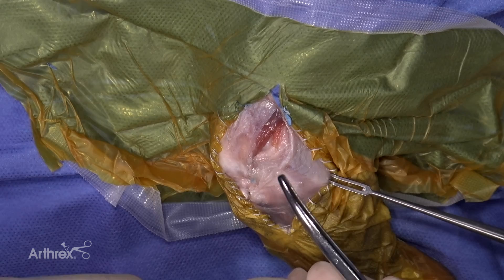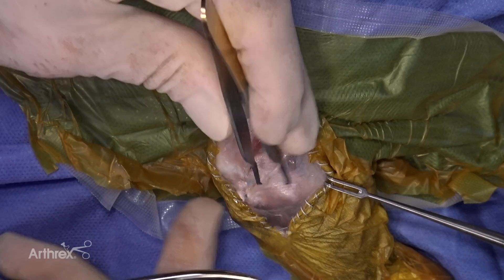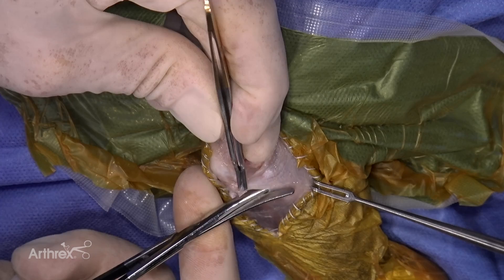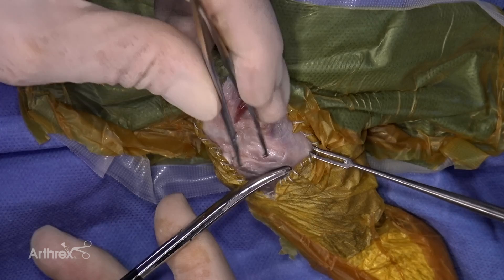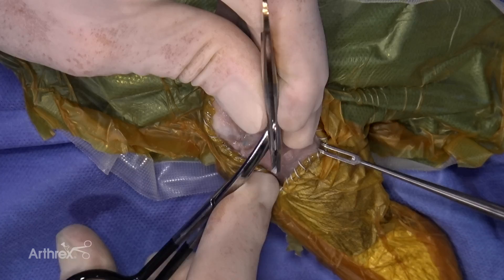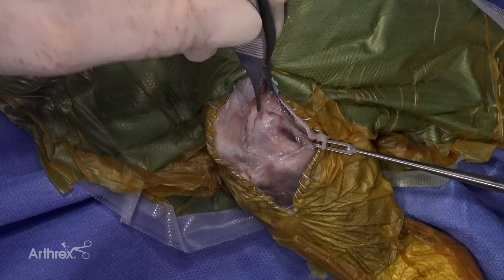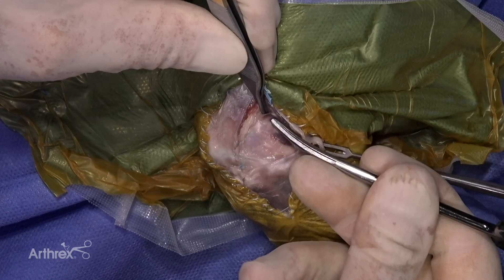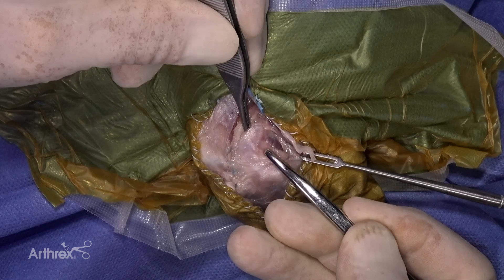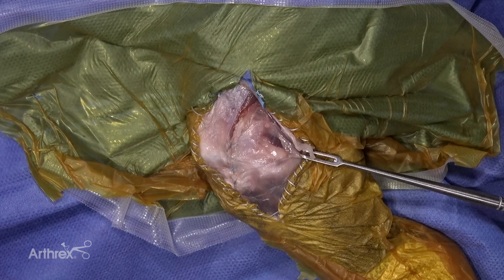We've closed the arthrotomy and now we'll expose the femoral site for application of the mini push lock. I'm going to pick up the fascia lata right at the joint line, tunnel underneath it, and incise it in this direction. Here's the lateral collateral and the head of the fibula — don't go too far back because the peroneal nerve is in that region. I'll reflect the fascia lata back, exposing the collateral ligament and the lateral fabella. It's very important to identify the fabella and make a small arthrotomy just distal to it, as that's your landmark for the femoral site.